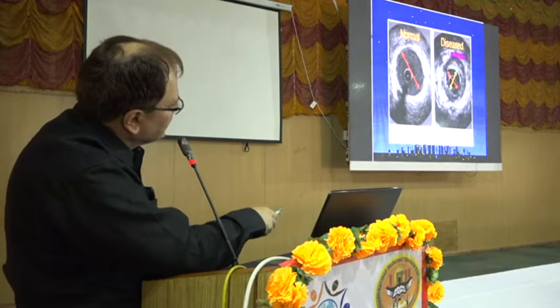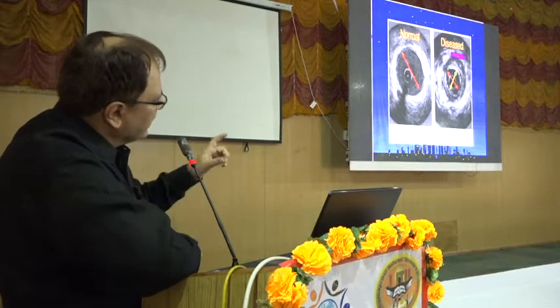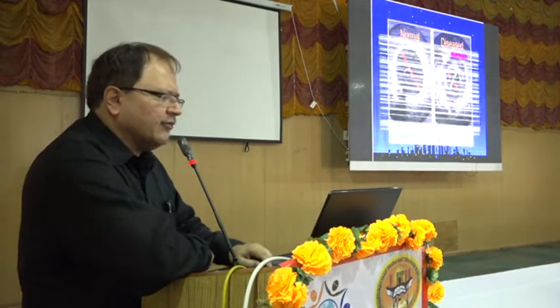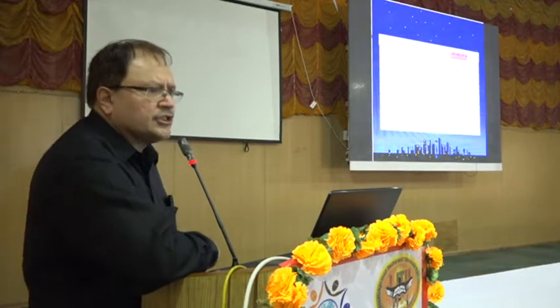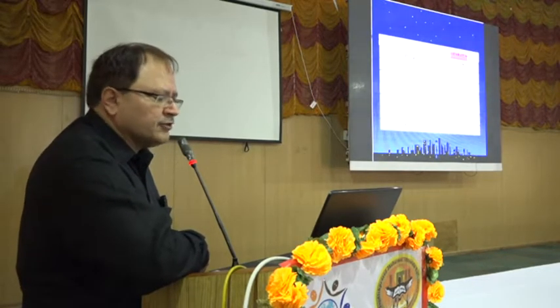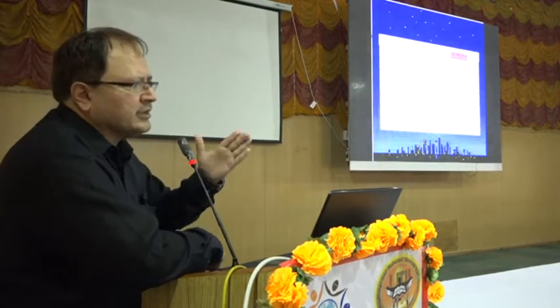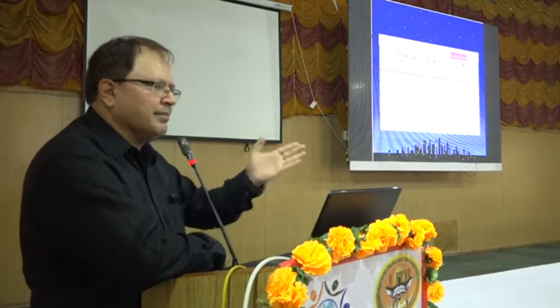And this is the diseased artery. You can see a lot of plaque burden is there, and we can manage this according to the plaque burden. What are the indications for IVUS? If a patient has got severe chest pain and normal coronary arteries, please go for IVUS to look for any ulcerated lesions. If a patient has intermediate lesions, suppose a patient comes to you with chest pain, his blocks are 60-70%. Now you have to decide whether you should go for angioplasty or he should be managed medically.